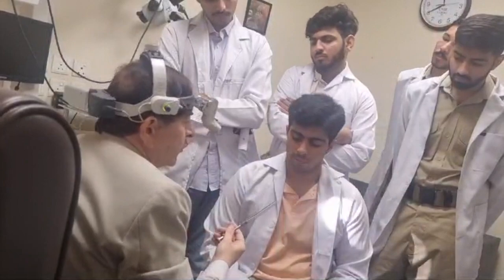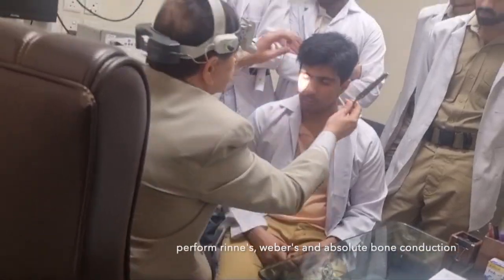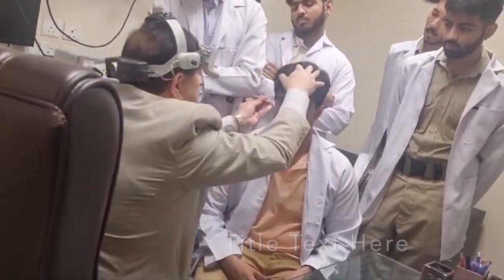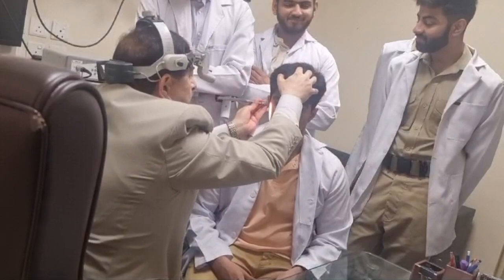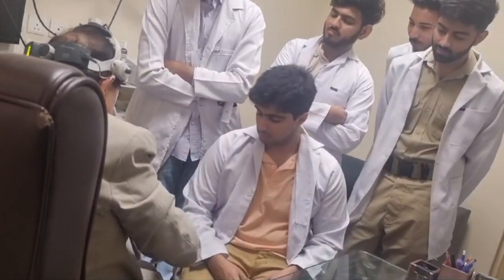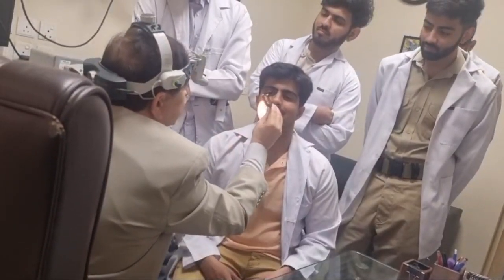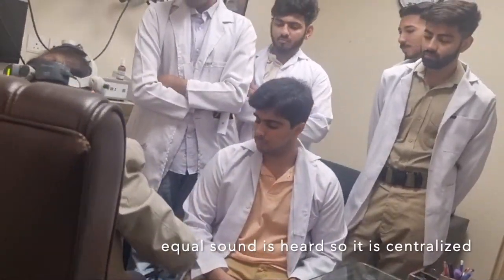Next comes the tuning fork. I have already told you it's 512 Hz. You strike it preferably at your knee. Close your eyes. Weber test is centralized. Next comes absolute bone conduction.